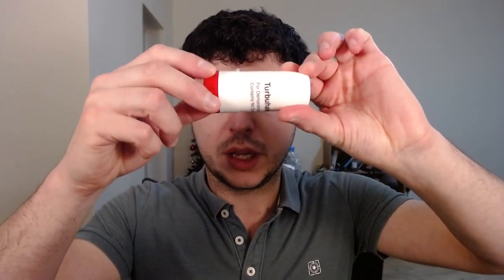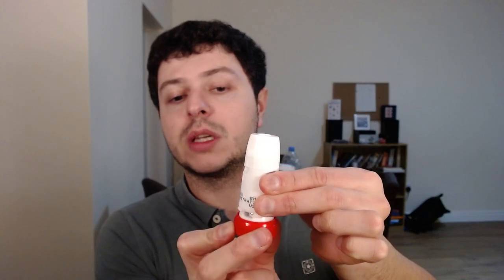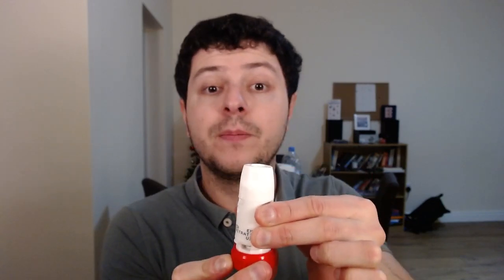It shouldn't be there. I'll demonstrate again so you get a bit more clarity. Holding it like this, twist the top off — you can see the dose counter a little bit better now. Then I activate it by twisting and twisting back, and you've heard the click. Now I'm ready to use it. And slowly release. Try to hold it in longer if you can.